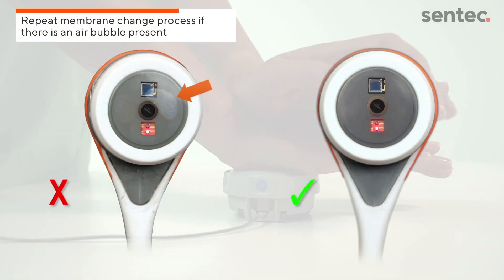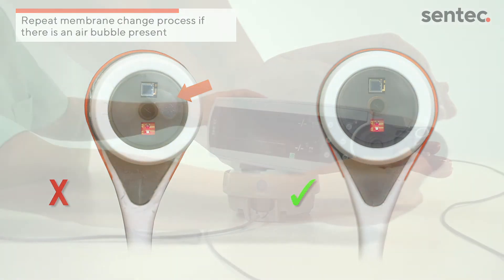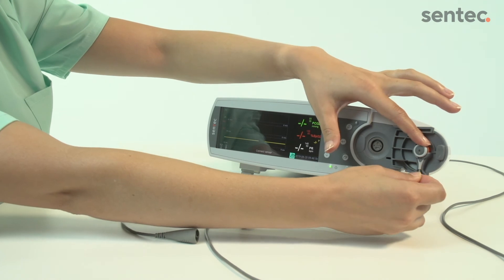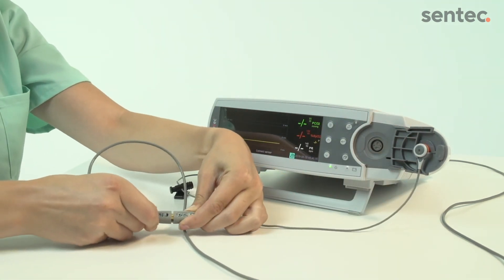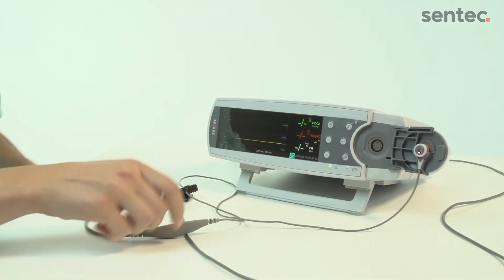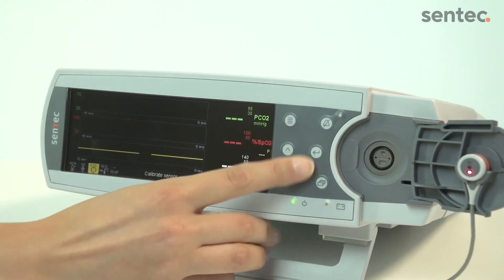Make sure that there are no air bubbles and verify that the membrane is correctly seated on the sensor. Reconnect the sensor and confirm the membrane change on the monitor by selecting Membrane Change Done in the third menu option.